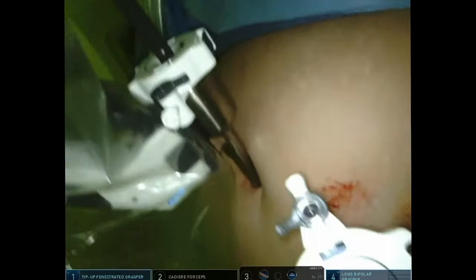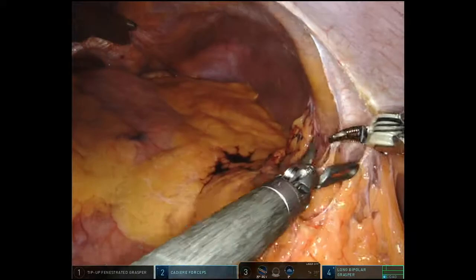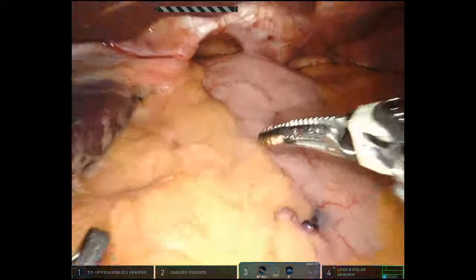Here's the operation — the whole operation beginning to end. You get a good look at the port setup as we introduce the 30-degree camera, which is in the down position most of the time. This patient had had some prior surgery — I think a colon resection — so I just used the bipolar to get through that. You can use a spatula if you want; the bipolar on the highest setting is fine. There you see the paraesophageal hernia.